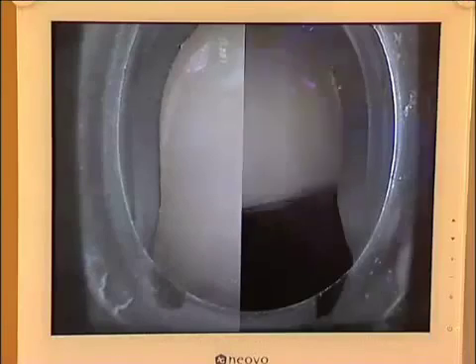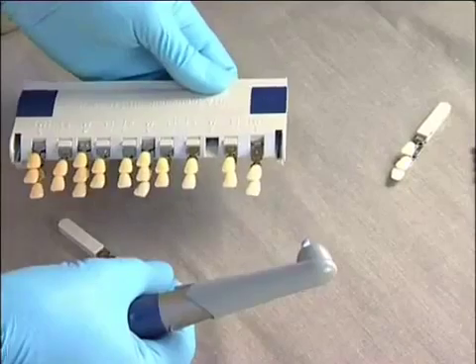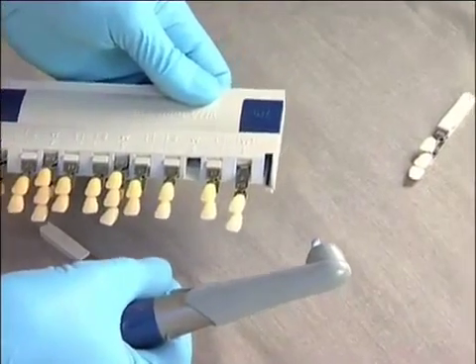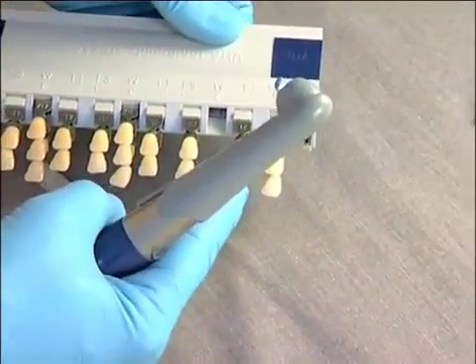These samples are obviously too saturated. We come back to the first sample. In the last step, we select the chromatic hue of the tooth to a more yellow shade, L group, or redder, R group.